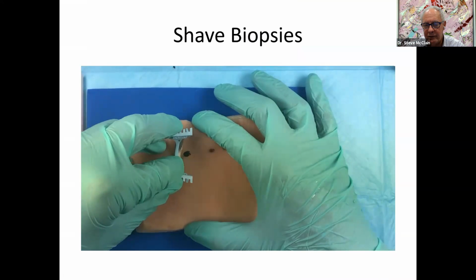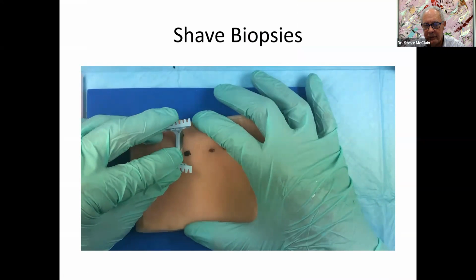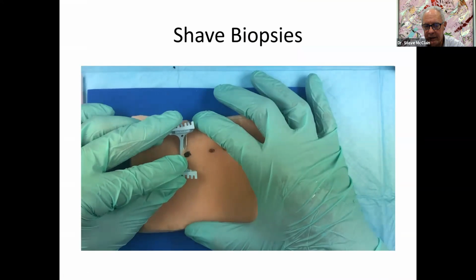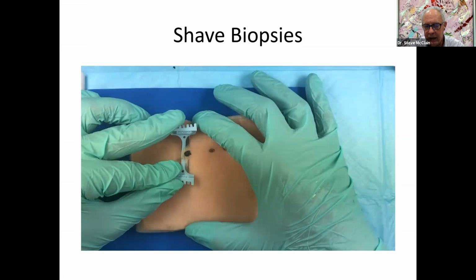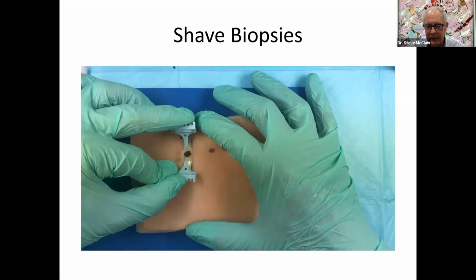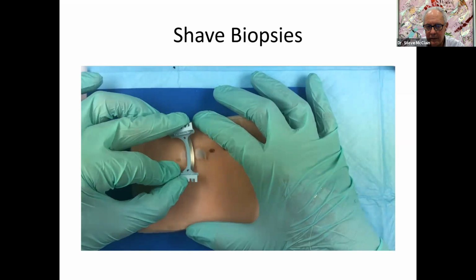And now he's slicing back and forth. He's literally rocking his fingers. And once you're in, you can flatten out the blade. See him flatten it. And now he's going to tilt it back to get out of the pig skin.